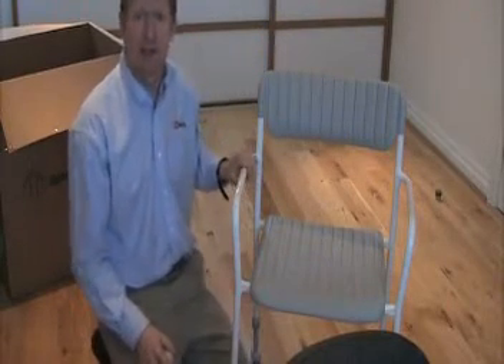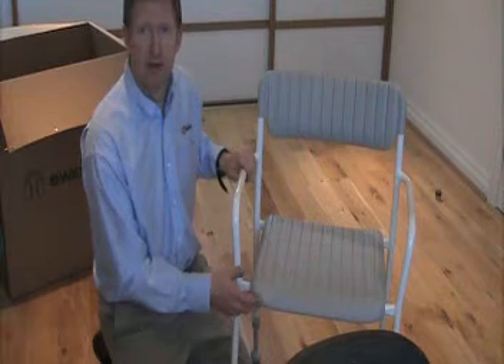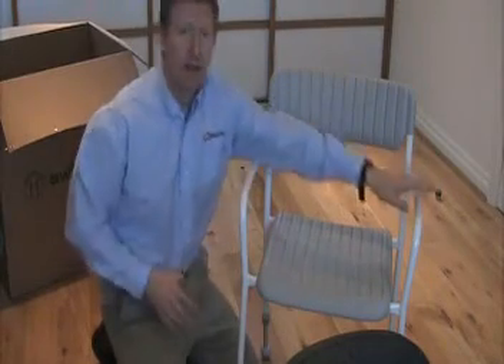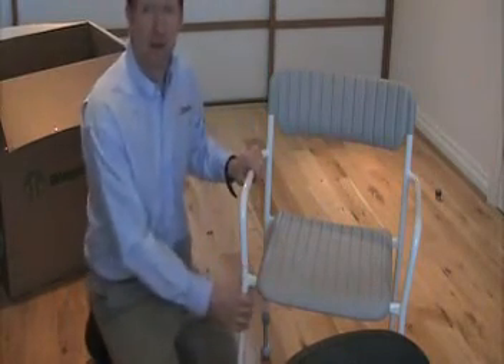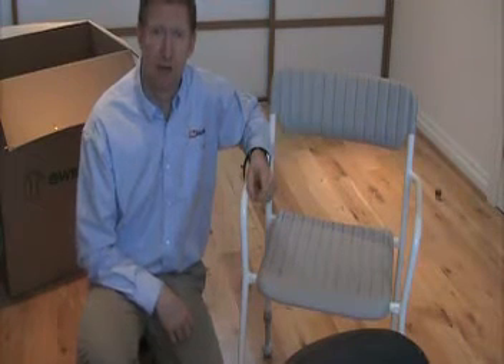It's quite a versatile shower chair and you can view all the details — the widths, the height and height ranges — on the website. It's got a user capacity of 130 kilograms and weighs roughly about 4.8 kilograms. Another feature of this chair is the armrests, which enable you to get out of the chair more easily if you need extra support. It's a very good quality chair. Another feature is the ability to stack the chairs on top of each other should you have a number of them — very useful for easy storage.